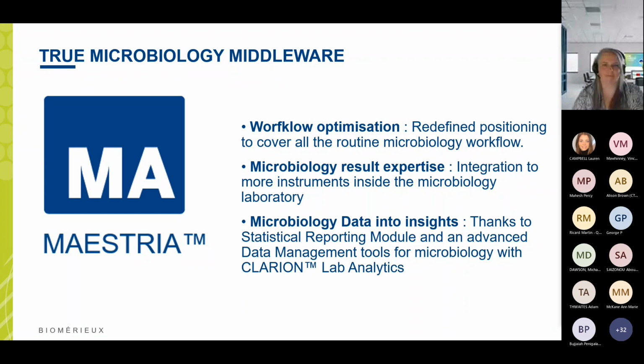And it's the improvements that, on previous versions of our middleware, can be broken down into three main areas. So we've got workflow optimization. So there's a redefined positioning to cover the customer's own microbiology workflow. So that's not just our instruments, but of course competitors' instruments. So we've got one tool for all of the microbiology activities.